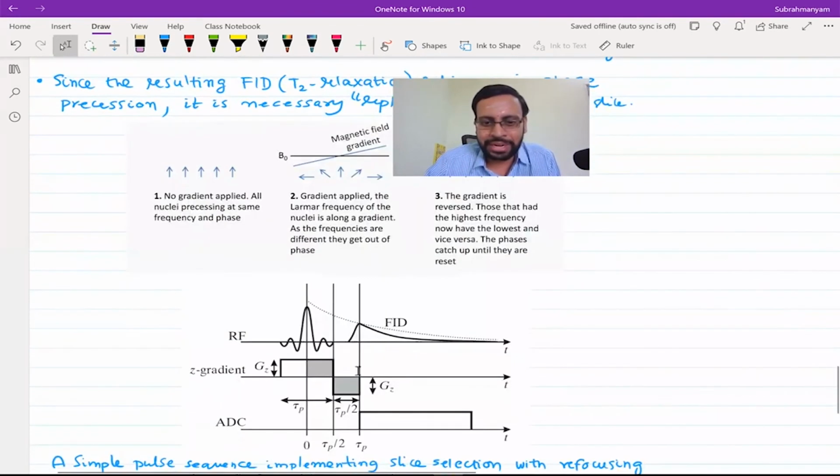So there is a time period up to which you need to apply it. To derive that constant, you should start again from the Bloch equation, which I don't want to do; perhaps it is not required for most of us. It is enough to know here that this will be half of the length at which the RF pulse has reached its peak on the envelope. From there till the end, you need to apply the equivalent magnitude.